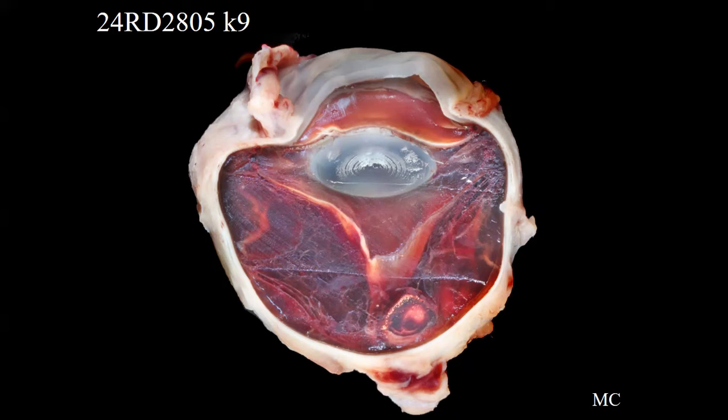The other feature that you can kind of see based on artifacts, as my blade passed through this globe, is this sort of chatter artifact. Basically the contents of this globe were very, very solid. Not all of it was opaque hemorrhage. If you were to hold this section of globe up to the light, it would have looked like a stained glass window. Basically, a lot of this is a high protein gel along with the hemorrhage. And that is also significant. So that's our gross exam.